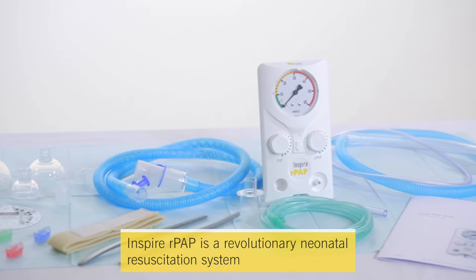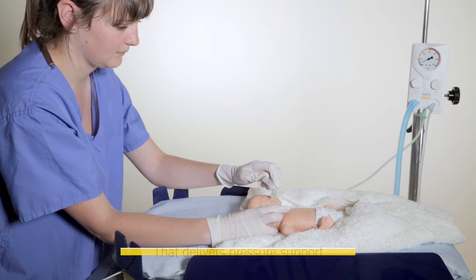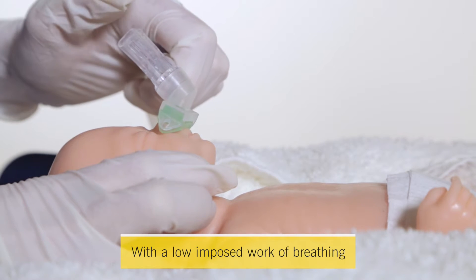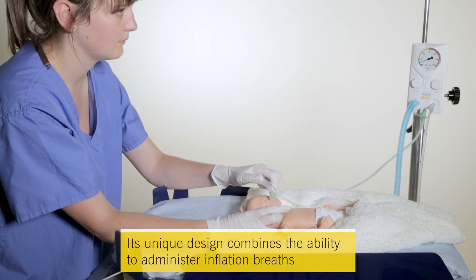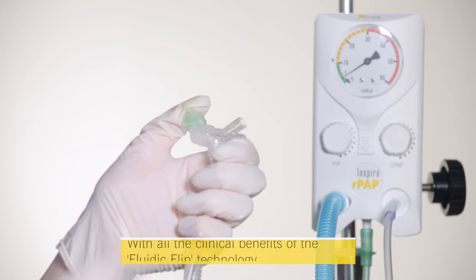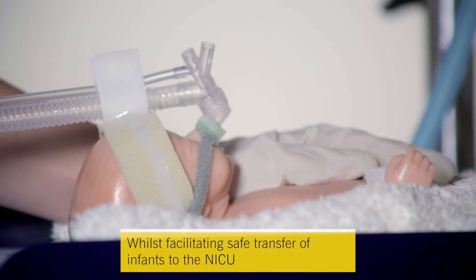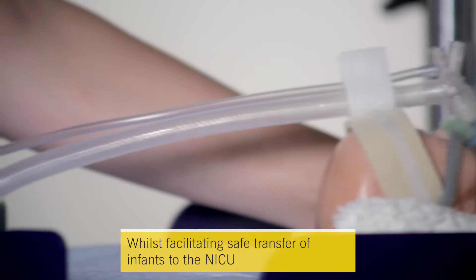Inspire RPAP is a revolutionary neonatal resuscitation system that delivers pressure support with low-imposed work of breathing. Its unique design combines the ability to administer inflation breaths with all the clinical benefits of the Fluidic Flip nasal CPAP technology, whilst facilitating safe transfer of infants to the NICU.